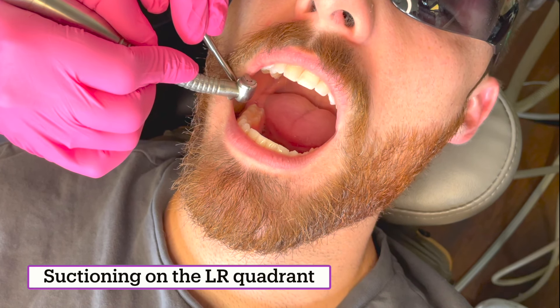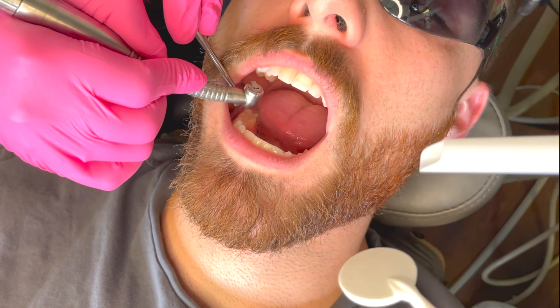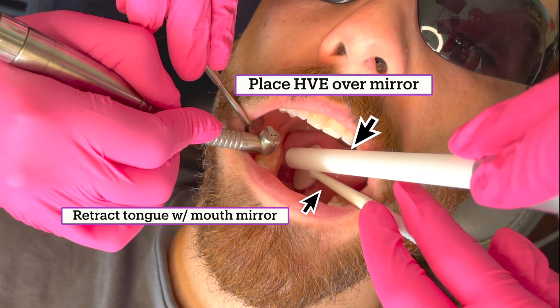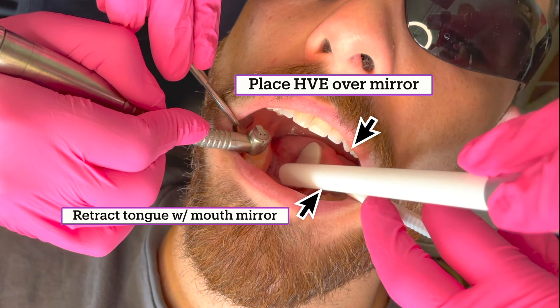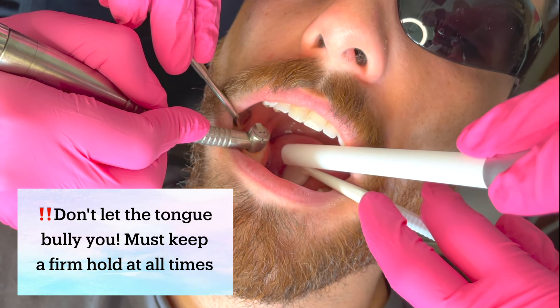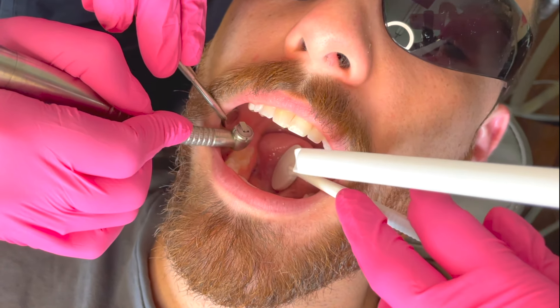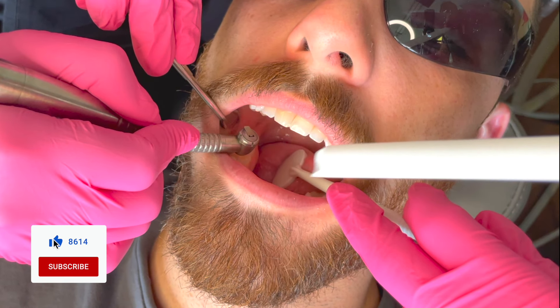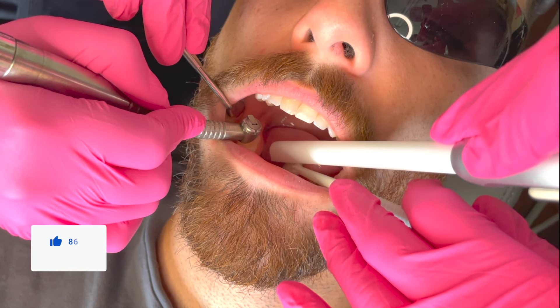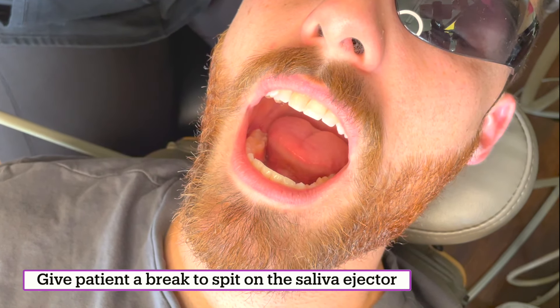We're working on the lower right. You're always going to need to retract something — almost always. Here I'm going to retract the tongue and place my suction right there. The tongue is sometimes going to bully you and push your mirror out, and you want to be firm — if it pushes you out, your suction can hit the handpiece. Push that tongue down firm and then put your suction in there. If the patient wants to swallow or move, get everything out of the mouth and stop.